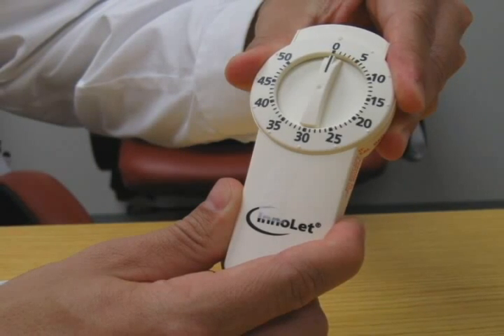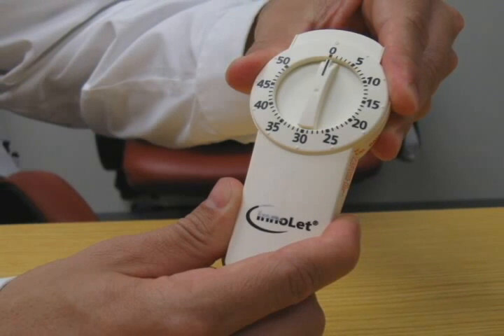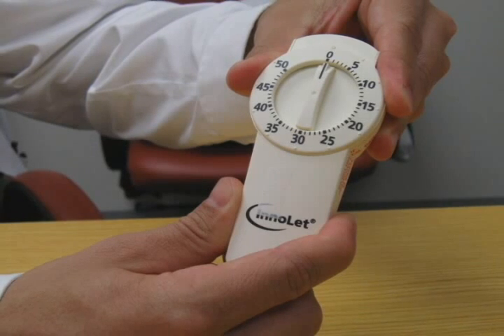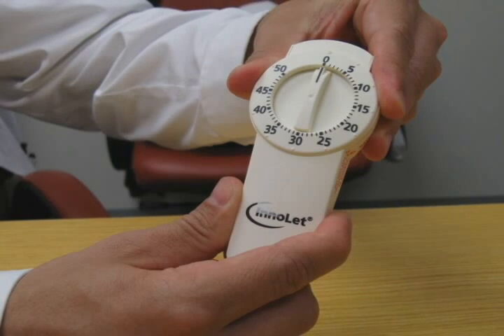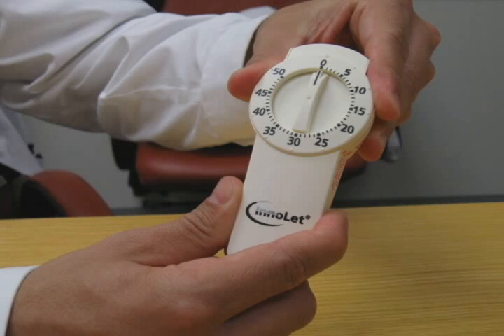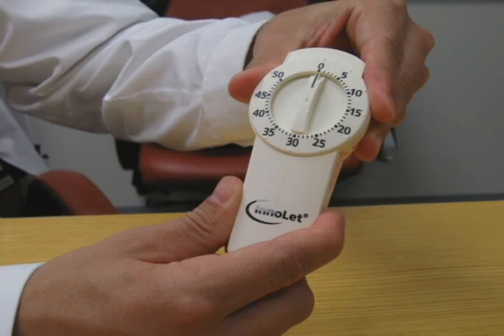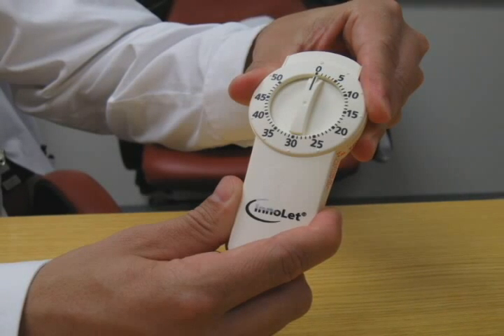This is a different type of pen — a reusable InnoLet pen. This pen device uses a dial, much like a kitchen timer, to set the dose and can deliver insulin in one unit increments. It is a delivery system specifically designed to suit the needs of insulin users with poor eyesight, reduced dexterity, and for those who found learning how to give injections difficult. This is a common device for insulins such as NPH insulin or an insulin mix of regular and NPH insulin called the 70-30.